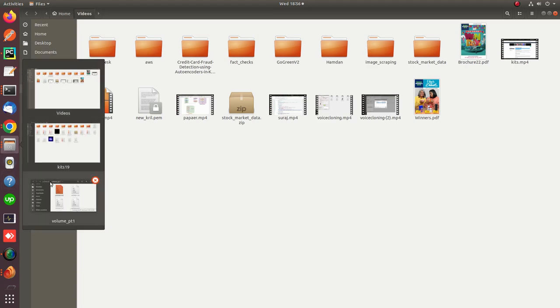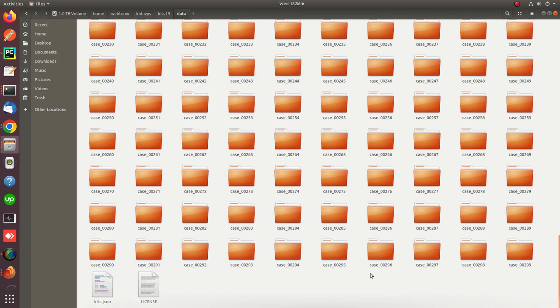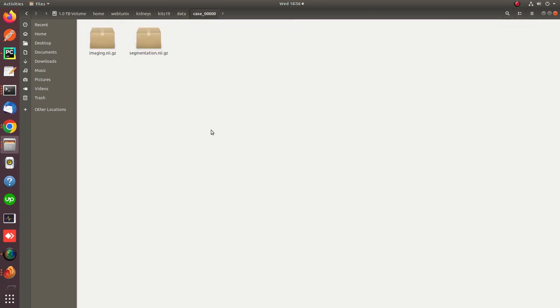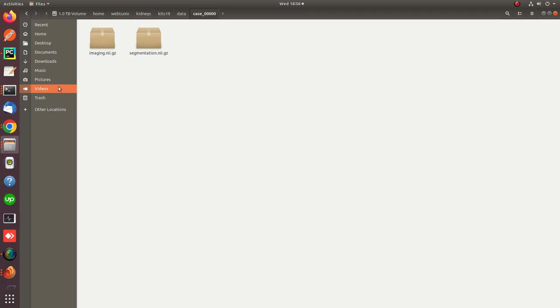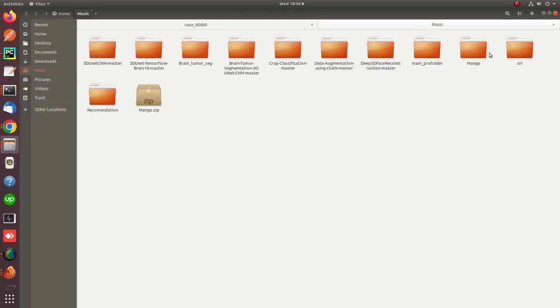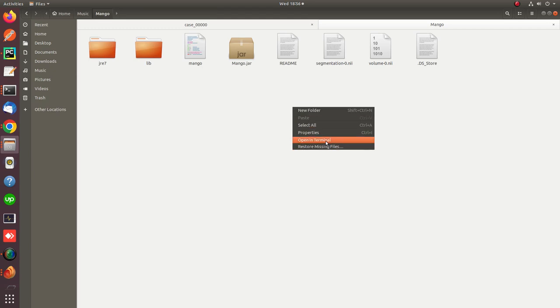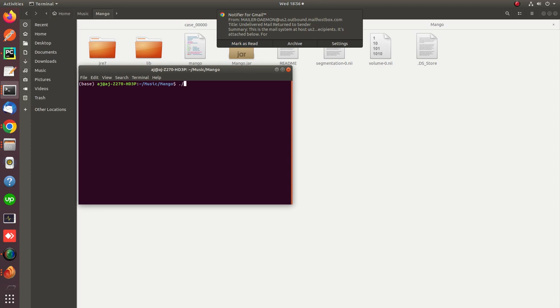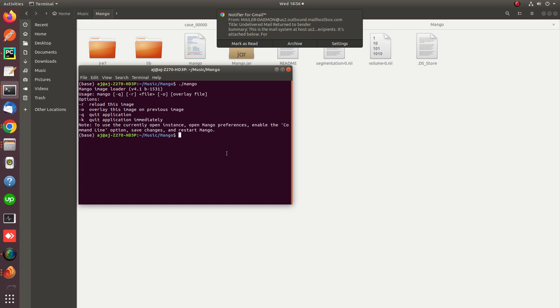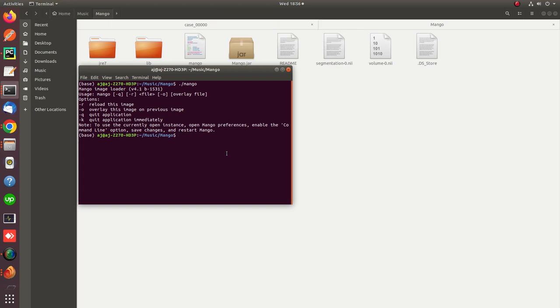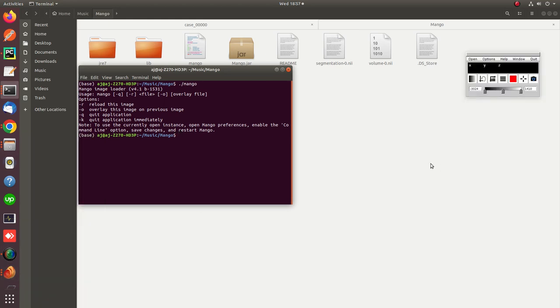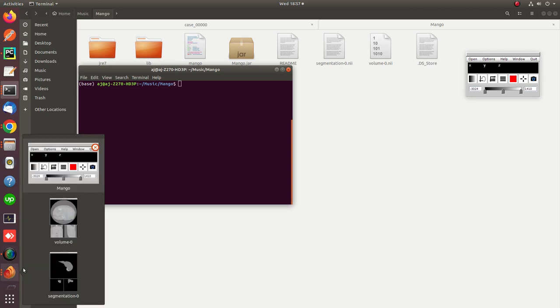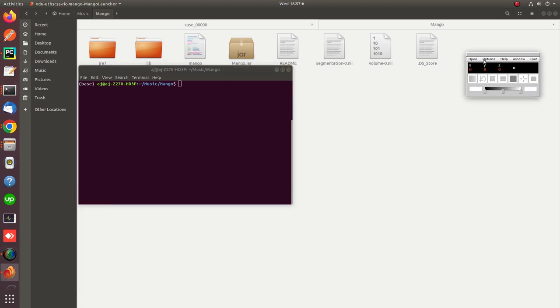Let me show you how the dataset looks once the download is complete. Here my dataset cases are available. Let me open one of the cases — it consists of an image and segmentation in NIfTI format. For visualization on a local computer you cannot see these images directly; you require a tool to view them. I'm using Mango here, though other tools are also available. It's important to understand the image first, because to create the algorithm you must understand the dataset and your required task.